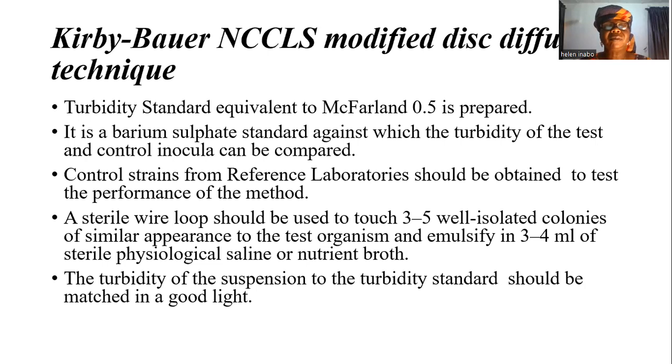And this involves preparing a turbidity standard equivalent to McFarland 0.5. Briefly, the turbidity standard is actually a barium sulfate standard against which the turbidity of the test and control inocula can be compared.